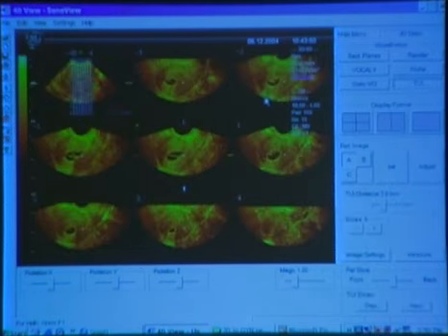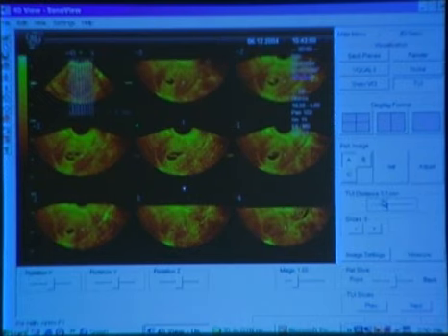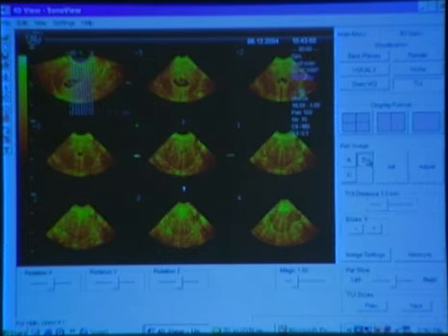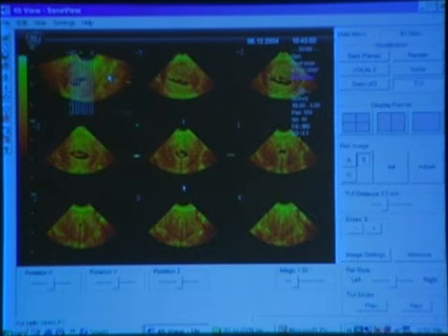And this one would display the sagittal image of the uterus and the fluids, and you can change the distance between the slices. And once again, I'm not here to say that anything you do I can do better, because you have done this for a long time already with CT and MRI, and we learned from these imaging modalities, but it became important for us to do, and it's so elegant and simple to do. You can then change it and look at it in the coronal, in the horizontal view, let me say.